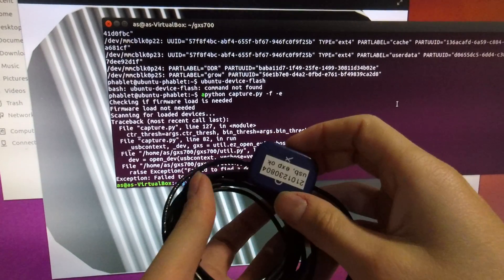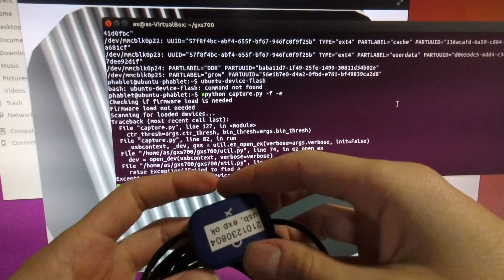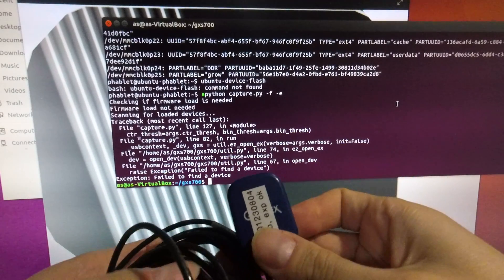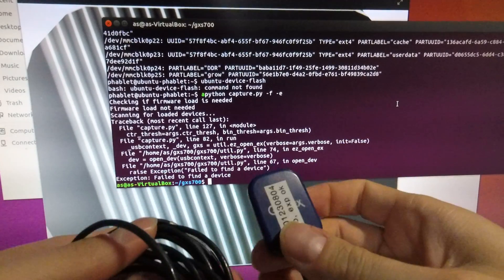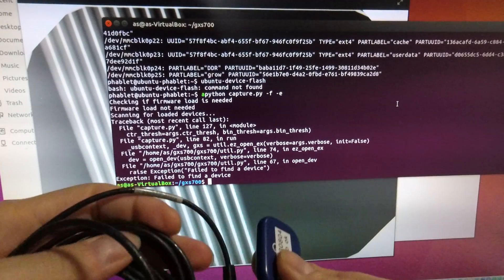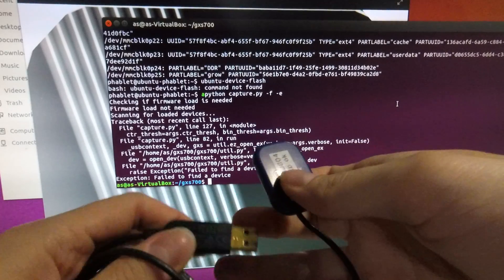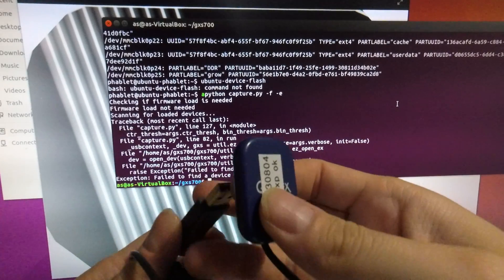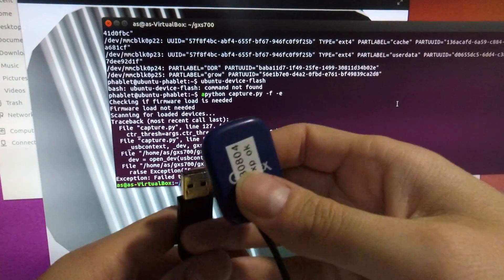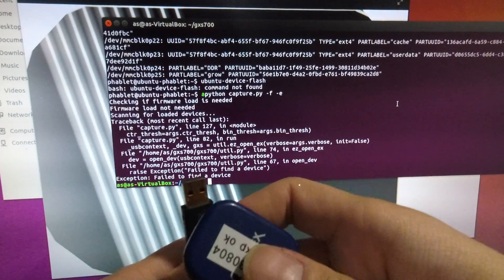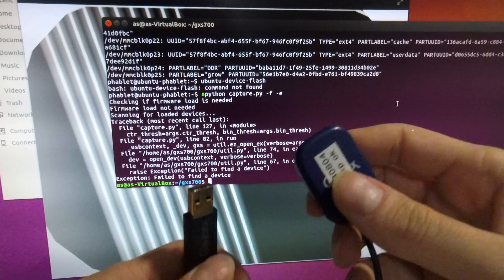Okay, so let's look at some of the ways we can interface the Gendex sensor with a computer. Now these are designed to interface through a USB port, a USB 2.0 into a PC.